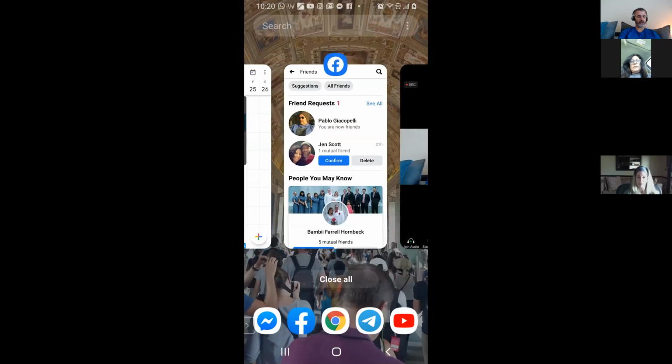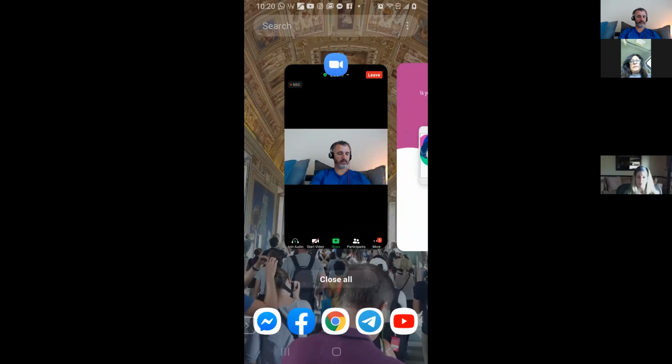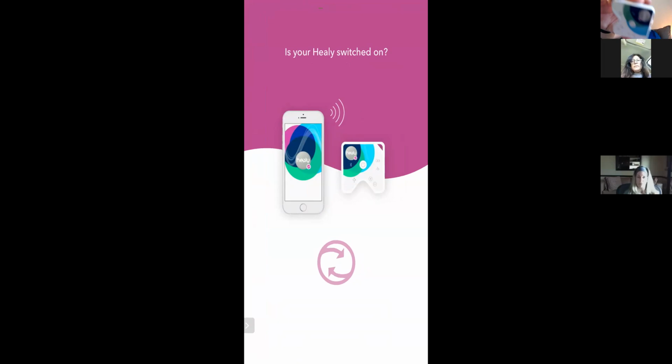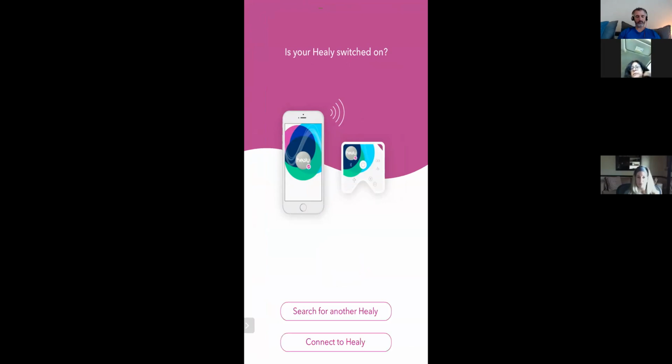I'm going to make sure that all the other programs are closed on my phone. And maybe we'll have an experience of how you work through it not wanting to connect. So I've pushed the button a couple times. I can see that it's on because the light is blinking. Sometimes just pushing the power button again gets it to work.